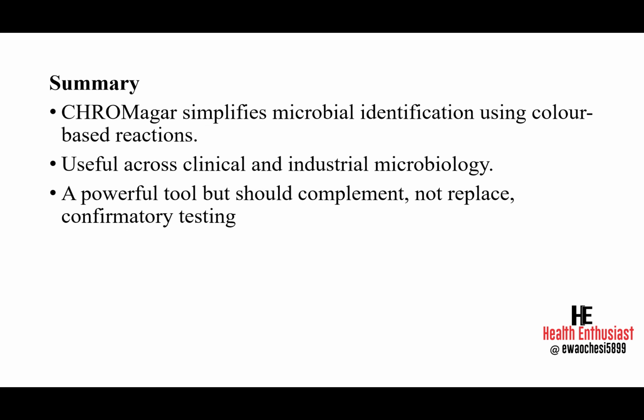So in summary, I've talked about CHROMagar. CHROMagar simplifies microbial identification using color-based reactions. CHROMagar is useful across clinical and industrial microbiology, and it is a powerful tool. But like I said, it should complement molecular identification and not replace it. Molecular identification of microorganisms is always the gold standard method for microbial identification.